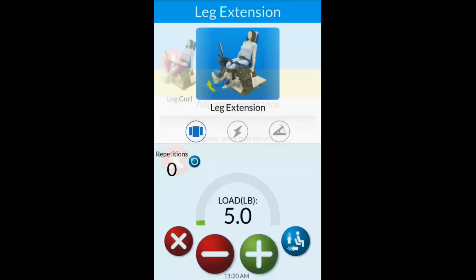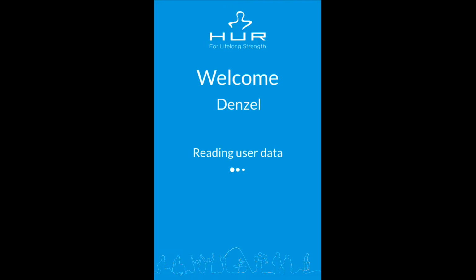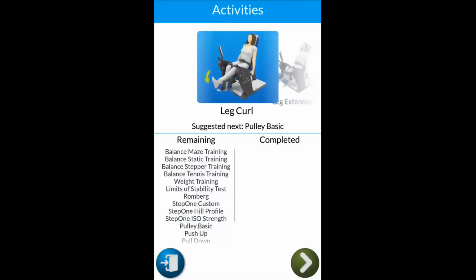Now let's look at using the machine with an assigned training program by badging or scanning into the machine's tablet. Once you have a training program and assigned RFID, touch the RFID to the ID symbol at the bottom of the tablet. When this is done, a welcome screen appears as the tablet is gathering the client's information. Once the training program is loaded, at the top, you can choose one of the activities available for the machine you are on by swiping left or right depending on if there are multiple activities.